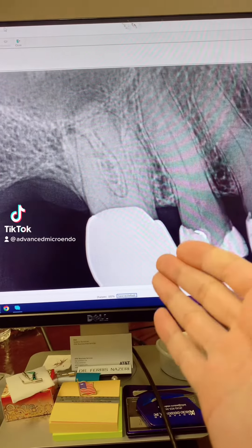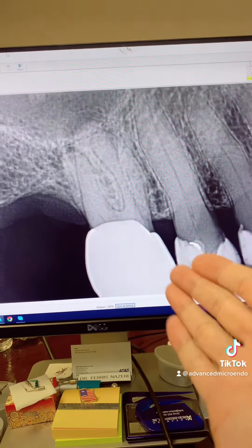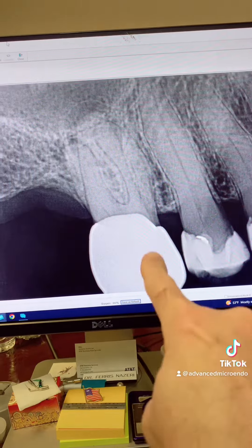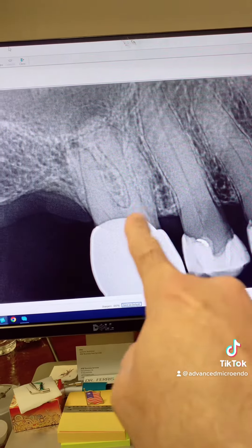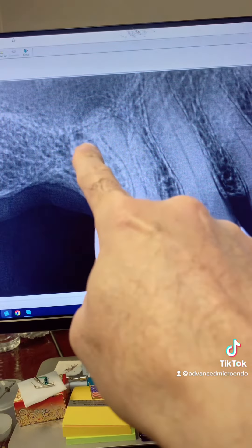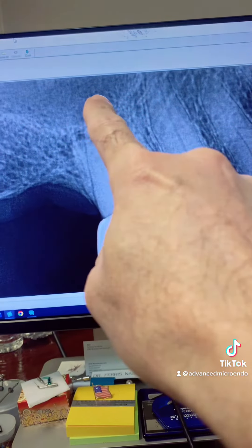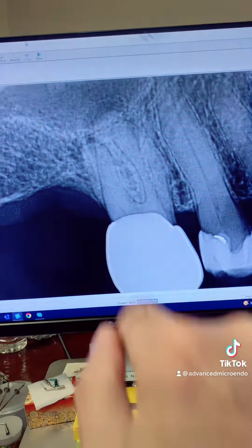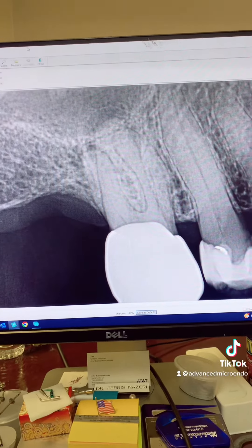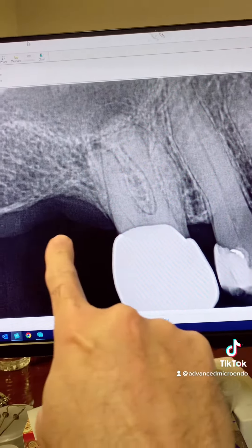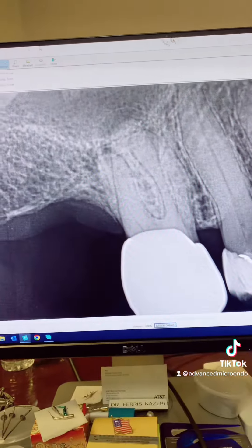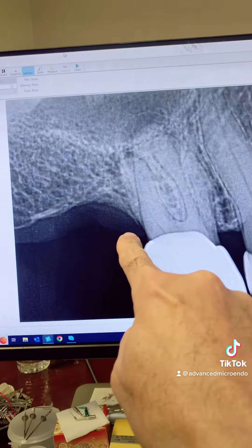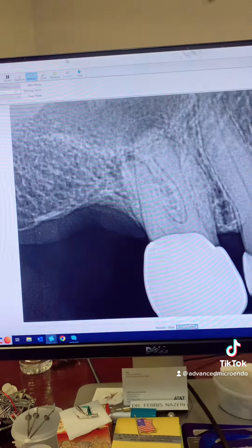This patient was referred to me for endodontic treatment of tooth number three — porcelain crown, calcified canals, as you can see, periapical lucencies here and here. There was also a sinus tract on the distal of the tooth on the ridge right there.